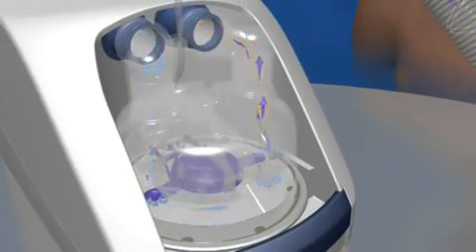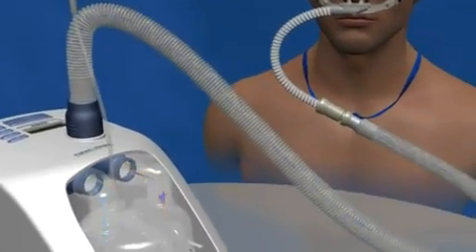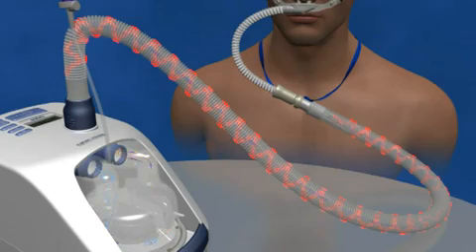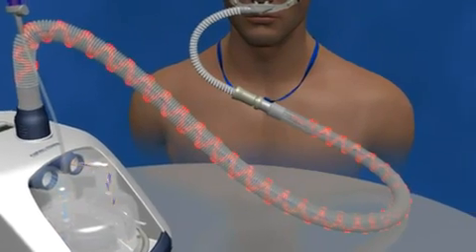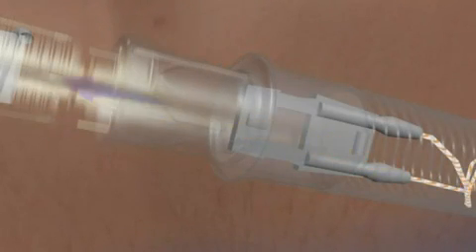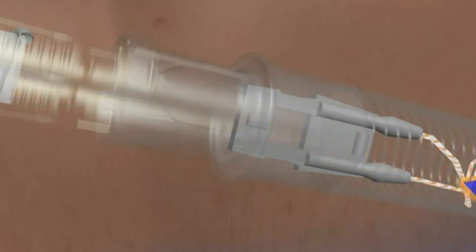This water vapor from the headspace in the water chamber enters the breathing tube through the port on top of the AIRVO. A heated wire inside the tube warms the humidified air to prevent condensation and to maintain the air temperature and water vapor content all the way to the patient. A sensor integrated at the end of the breathing tube allows precise control of the temperature and humidity of the respiratory gas supplied. No external probes or sensors are required.